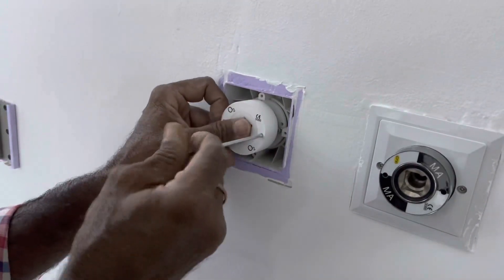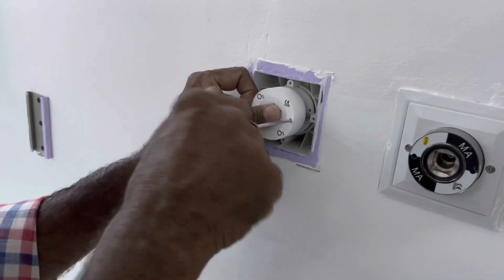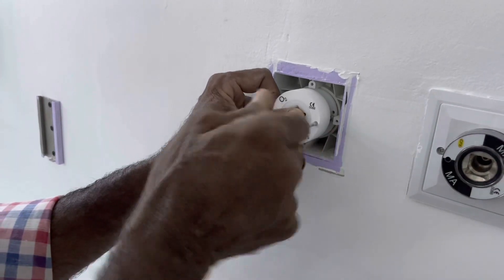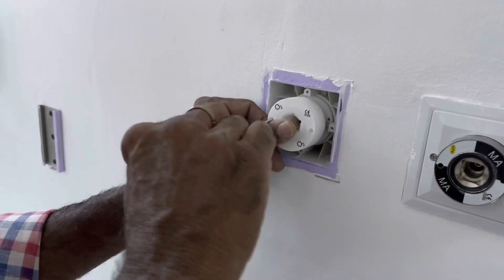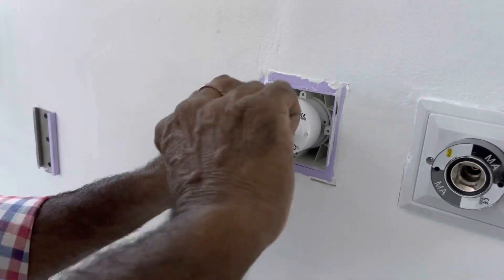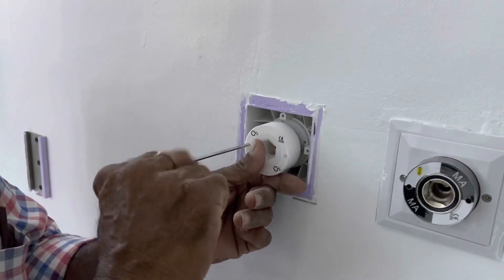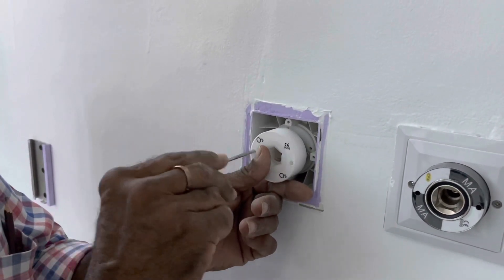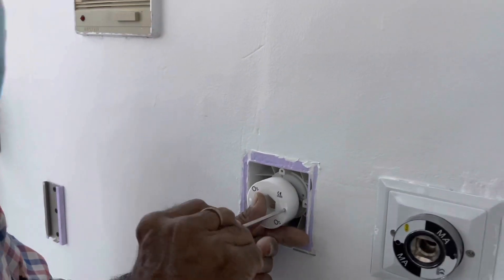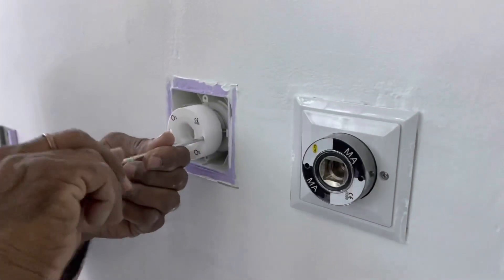Tighten both Allen key screws to avoid shaking and leaking from the bottom side. This will also help with installing and removing the flow meter very easily without any shaking, securing the outlet.